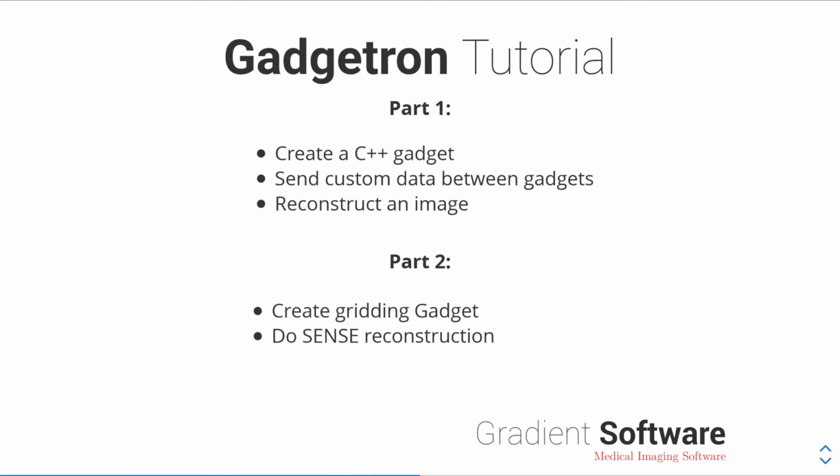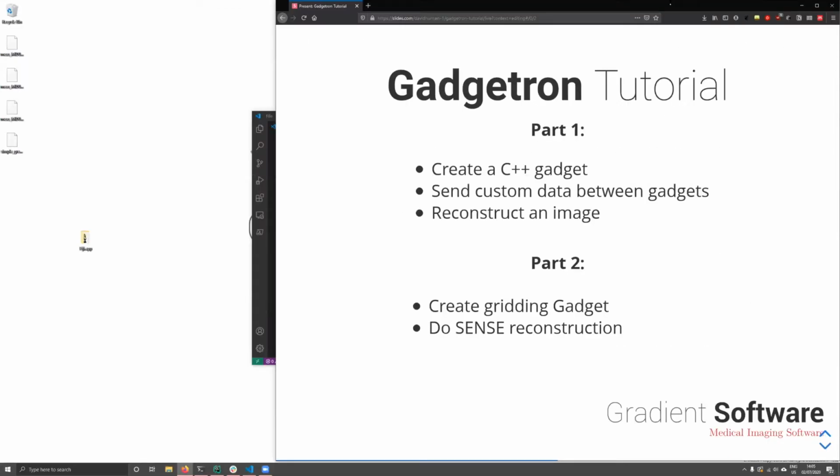And then in the interest of time, I will present how to write a non-Cartesian gadget, first for gridding and then for sense. But we don't have time to do that as a live coding exercise. So that will just be me going through code. But let's start out.